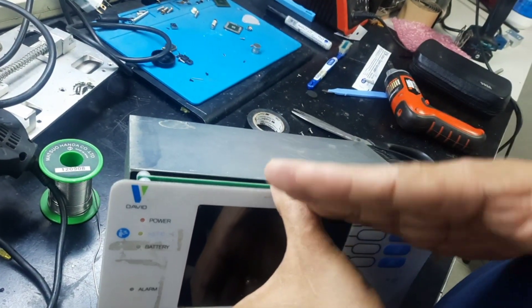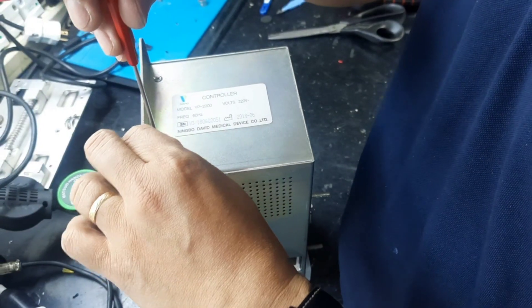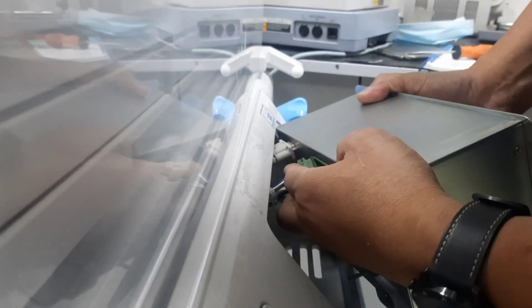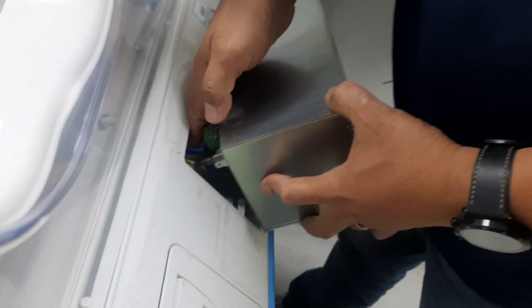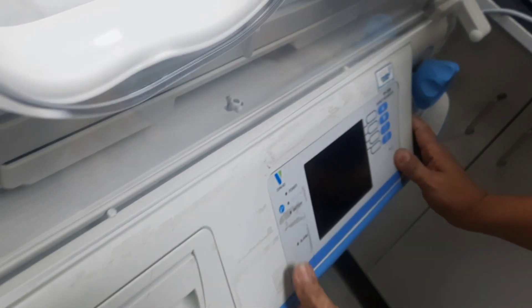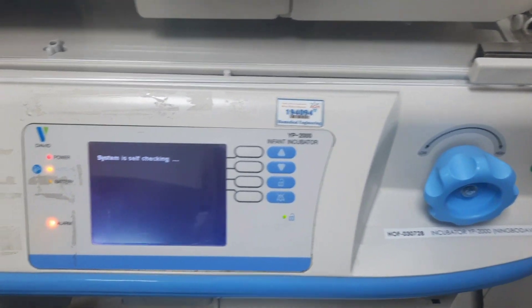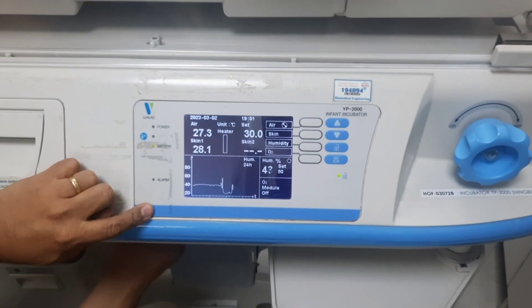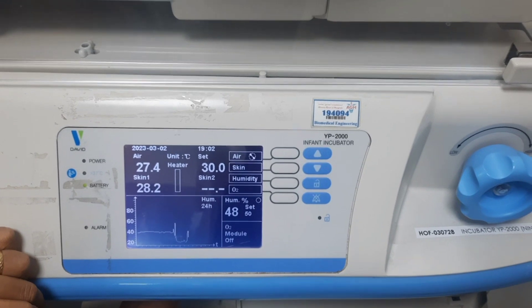The flow is going out, not going inside. It will alarm. Thank you. Thank you.